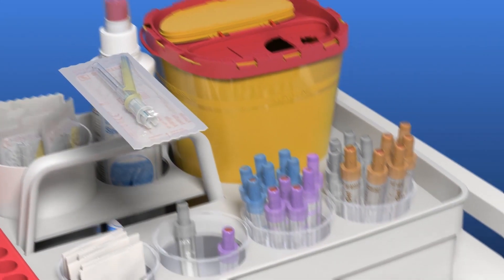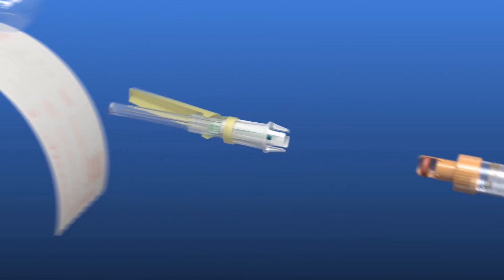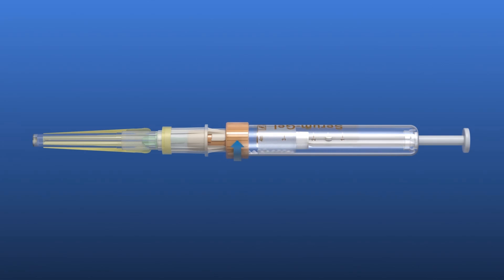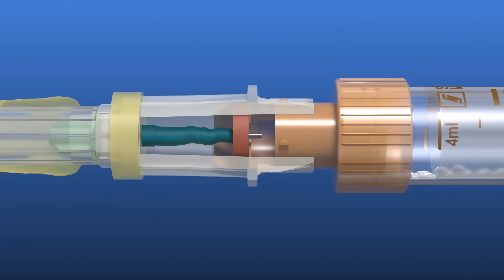Remove the safety needle from the packaging. Thanks to the peel-off opening, this can be done without having to touch the safety needle. Connect the first S. Monovet to the safety needle for collection using the aspiration technique. To do this, slide the S. Monovet into the integrated holder and turn it clockwise.